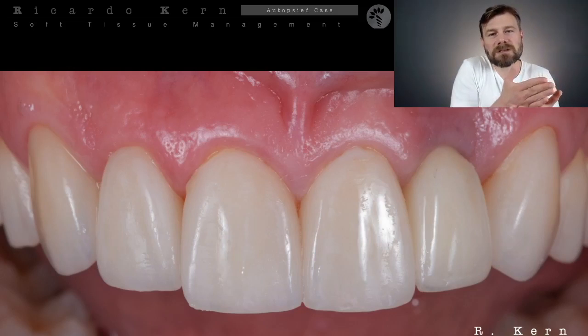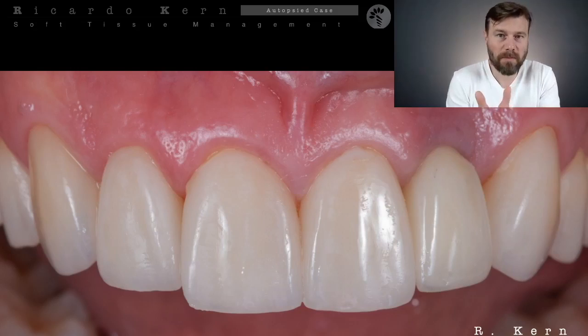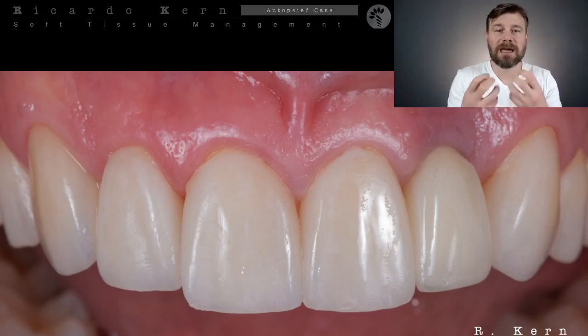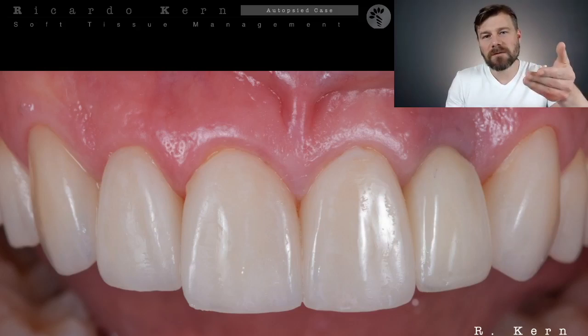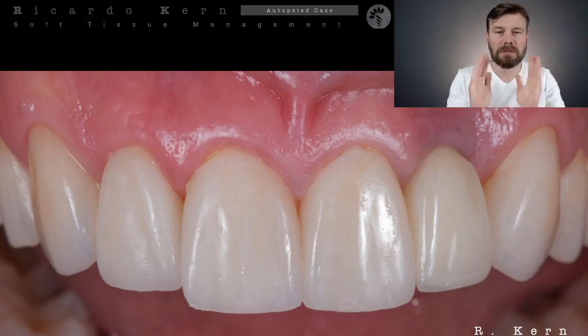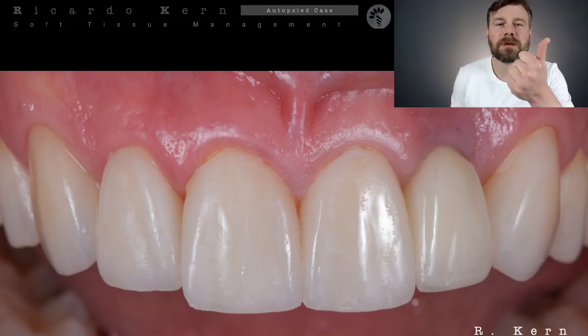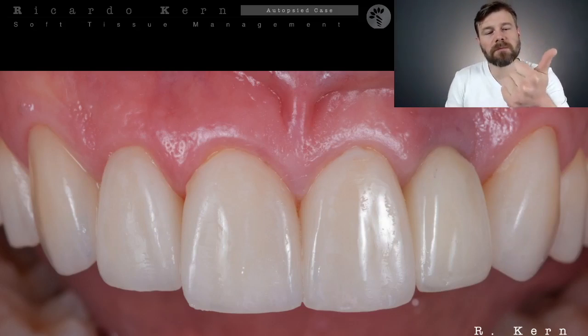If we cannot treat this peri-implantitis in the 6 millimeter pocket, giving back health to this area, and we intend to graft on top of that, that's not going to work in the long run. So we also need to remove this implant and start a new treatment. But okay, let's assume that I have less than 3 millimeters of bone loss around my implant.